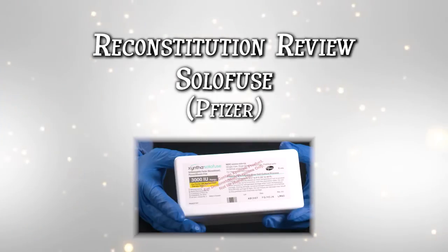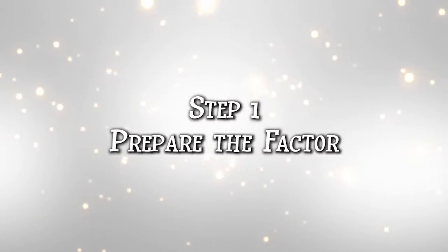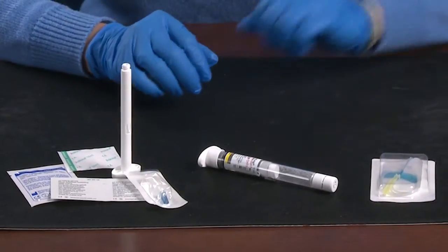Welcome to Reconstitution Review with SoloFuse, which can be used with any of the Pfizer products. Once you have everything together, remove it from the box and place it all on a clean surface.